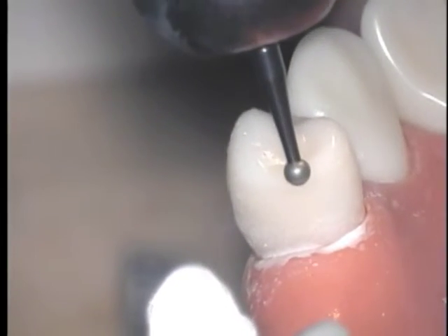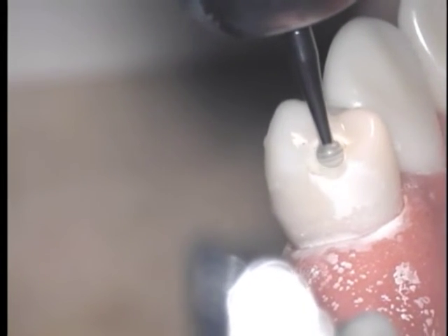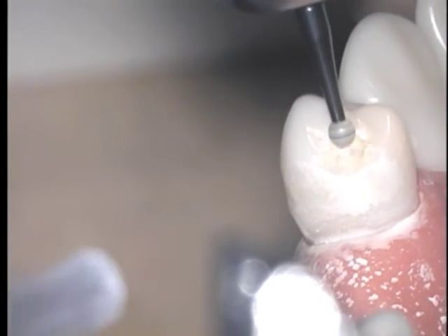The procedure for the premolar occlusal rest seat is similar. First, reduce the marginal ridge and fossa area, then widen the marginal ridge area, and finally deepen the central portion of the rest seat to ensure the rest seat is positive.